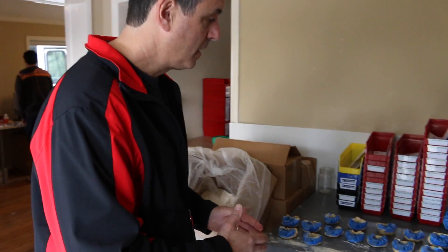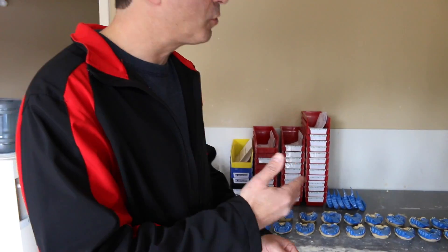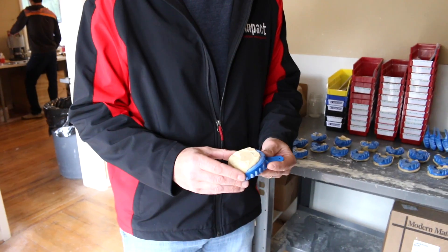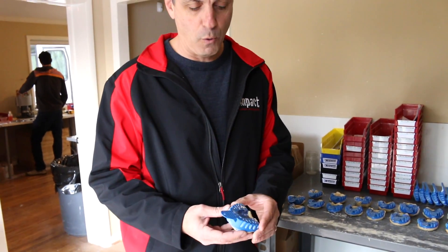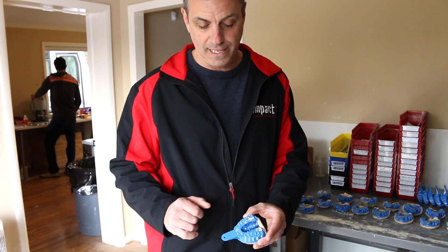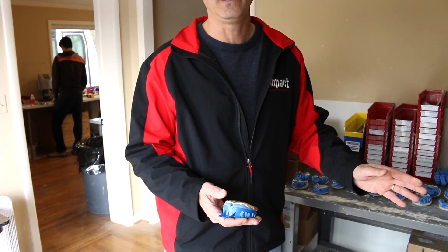Once we have your impression on hand and it's all labeled, we bring it into our room where we pour the models. What you're seeing here are roughly poured stone models of each person's mouth that has sent in an impression. Prior to it getting cleaned up, which we'll show you in a few moments, you can see it's labeled as we've mentioned earlier. What John is doing here — you might hear the clicking in the background — is cracking the models out of the impression.